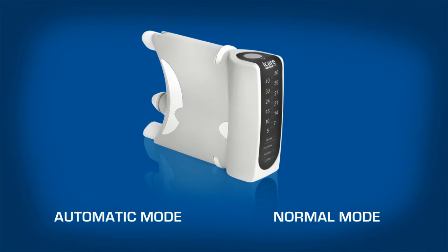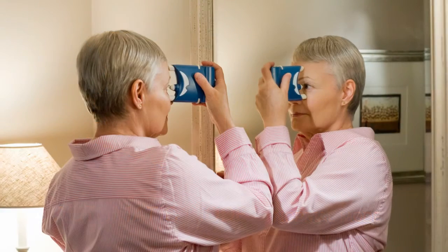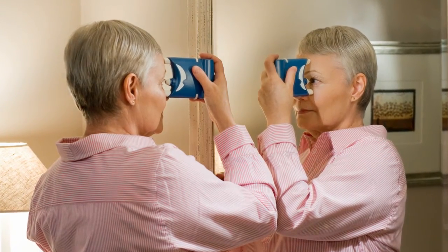The way you take measurements depends on the chosen mode. In automatic mode, press the measurement button once to perform the measurement. A long beep indicates the end of one measurement sequence of six measurements. Automatic mode is especially useful in self-tonometry.